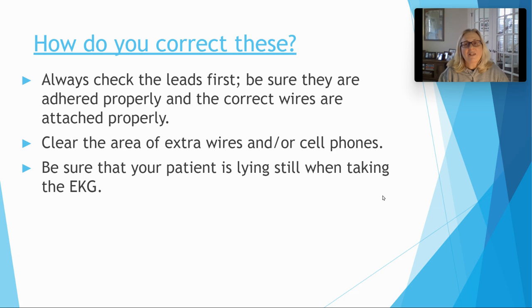Make sure your patient is lying still. If you are the patient for one of your friends, please be compliant and try to hold still so you can get a good EKG. You're just holding everybody up if you're acting a fool. Okay, so just lay nice and still.